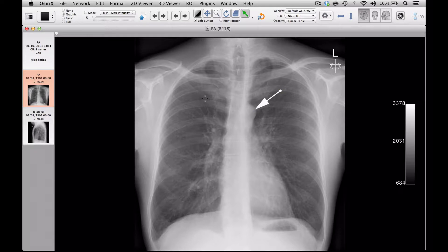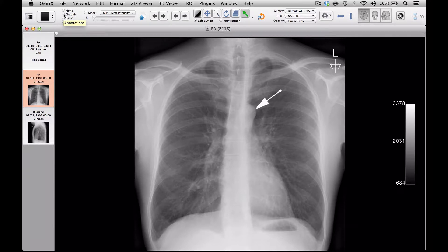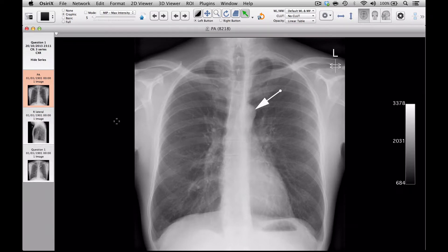Now I want to, as we normally do in OSIRIX, preserve something we've done to an image by exporting it as a new DICOM file. You'll see that if I take the graphics off, I'm going to lose the arrow, so I'm going to keep that on. Now I'm going to export the image — image only, keeping the regions of interest on because I want to keep the arrow there. In this case I will call this one Question 1 and press OK. Now if you look at my list of questions, I've now got something called Question 1, which has an arrow pointing to the aortic arch.